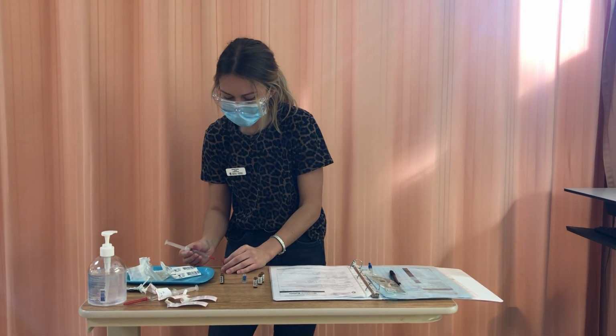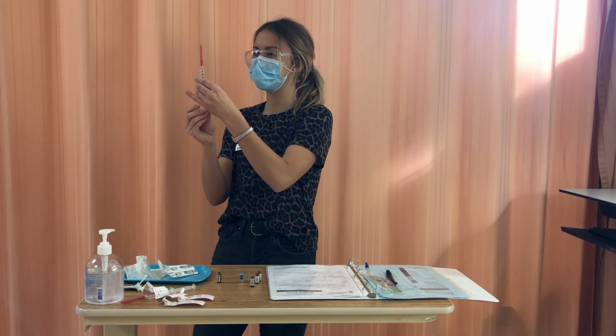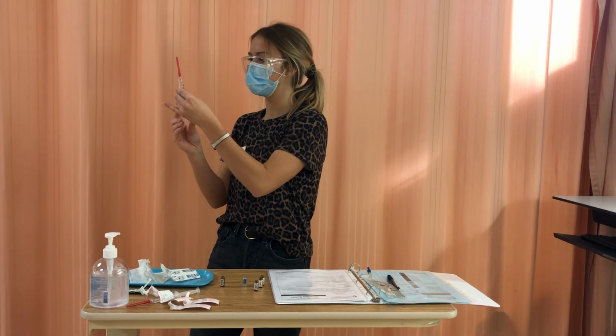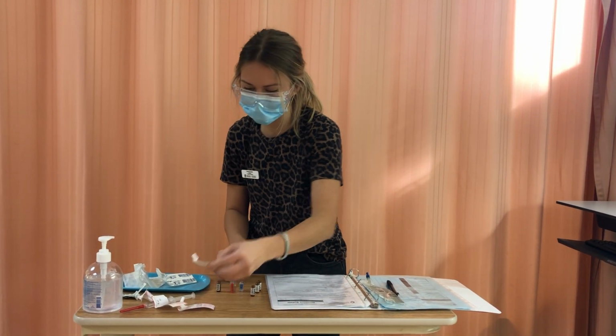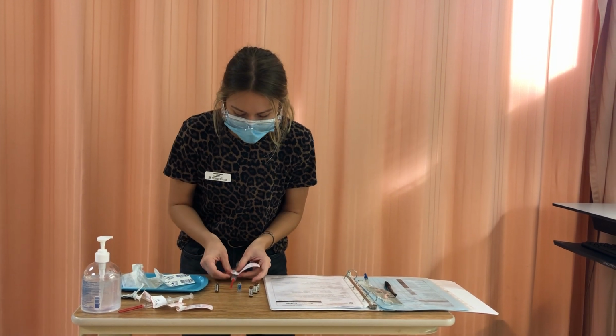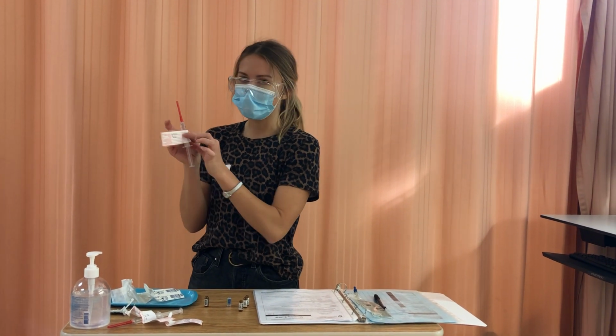So what I would then get my nurse to do is have him come and make sure this is all correct. He says I do absolutely perfect work. Right, so I have 5 ml, so I'm just going to label this now with my morphine. So I have morphine 50 milligrams for 5 ml, so my second nurse knows, and I'm going to put these in the waste.